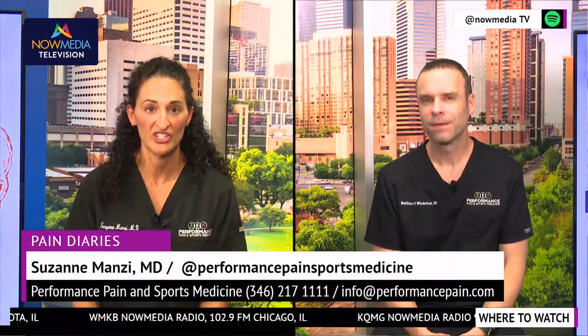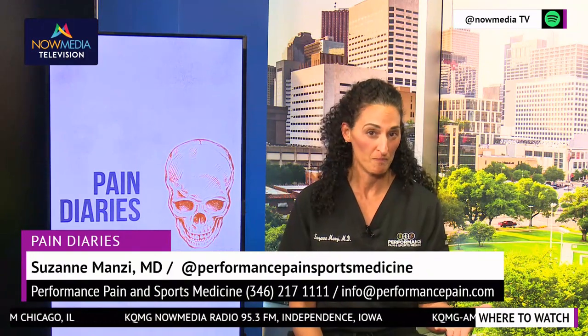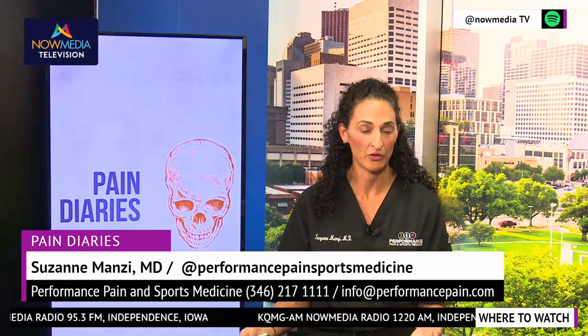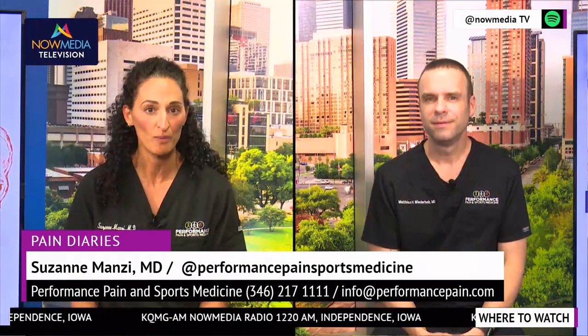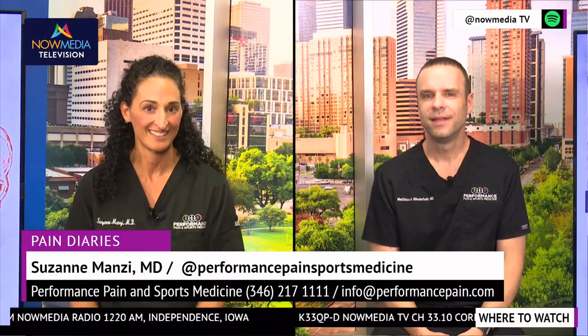Well, I mean, we've been treating these patients for years and years, and I feel like the indications for using spinal cord stimulation just keep increasing. And so, we used to treat it mostly for those people that had back surgery, and they didn't get any better because they had that chronic leg pain as well. But now we have all these other indications, so there's so many more potential opportunities for people to get treated for their chronic pain because of this.